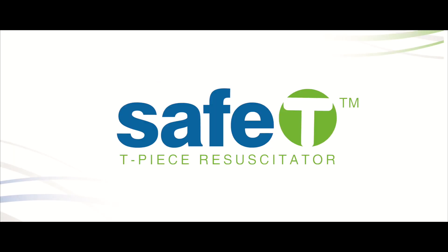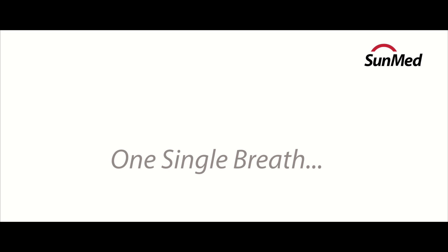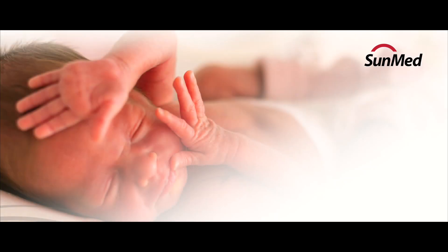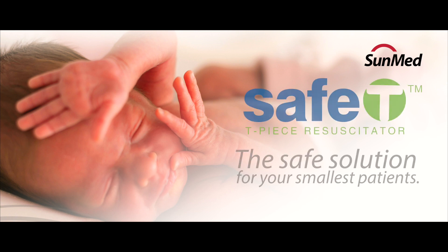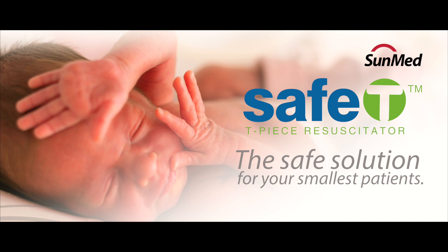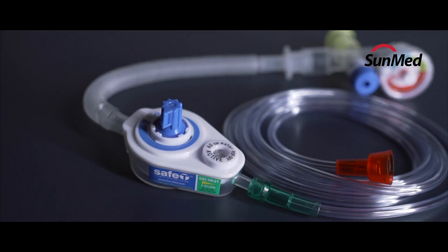Neonatal resuscitation can be a life-saving event, but all it takes is one single breath of excessive barometric pressure to leave an infant with permanent lung damage. When a baby's life is at stake, the Safe-Tee T-Piece Resuscitator is a safe solution for delivering consistent PIP and PEEP with every breath.